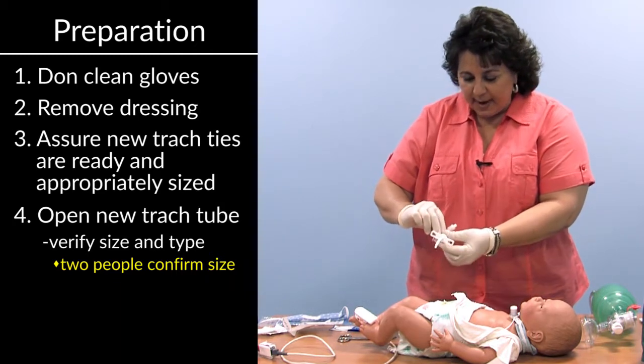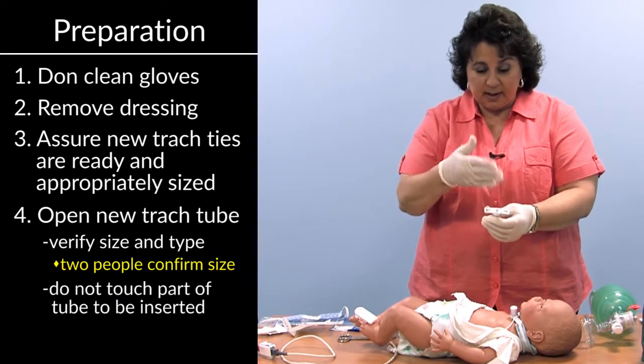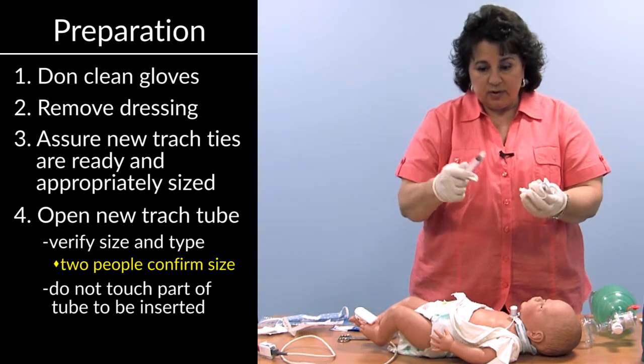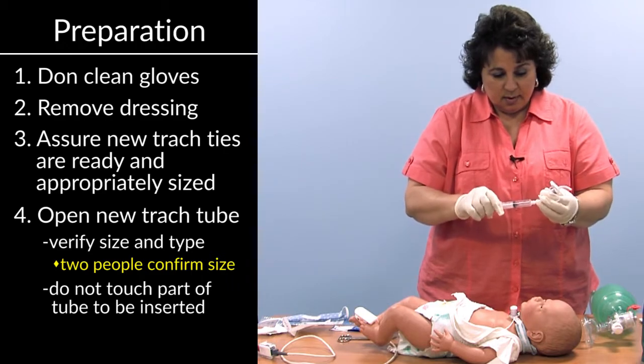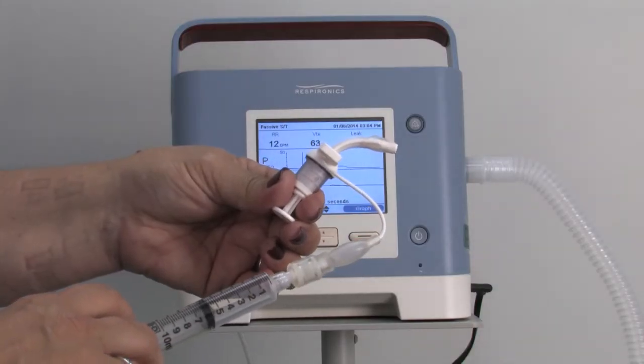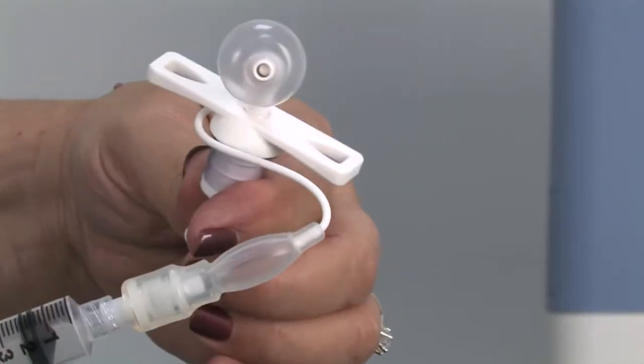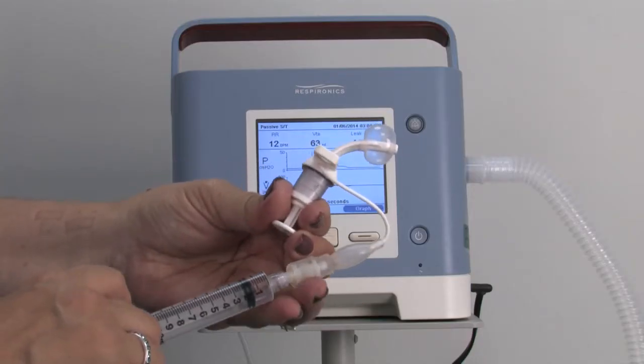So I'm going to remove it from the package, but I'm not going to touch with my gloves the part that's going to be inserted. What I'm going to do is take a syringe, and I'm going to inflate the balloon on this tracheostomy tube. I want to assure that it inflates properly and evenly around.